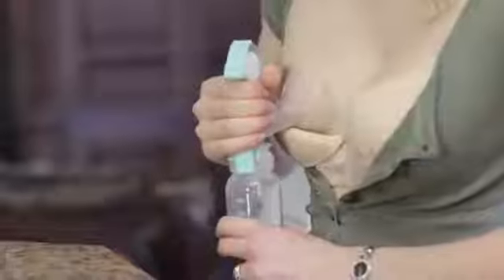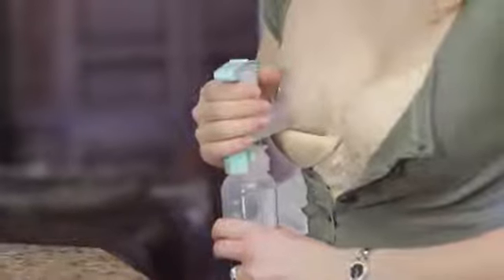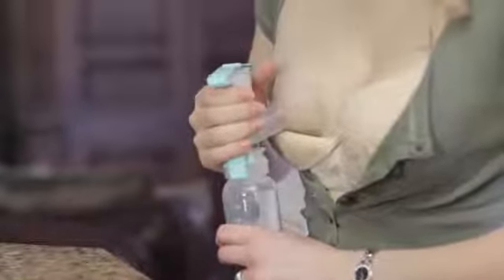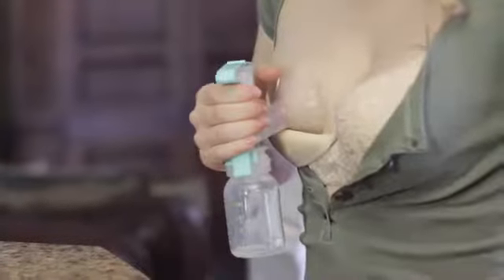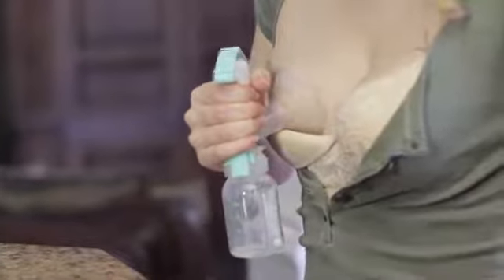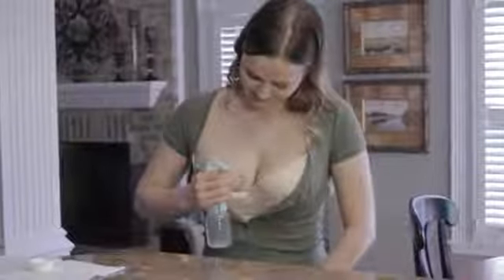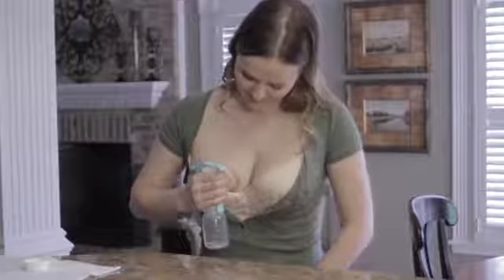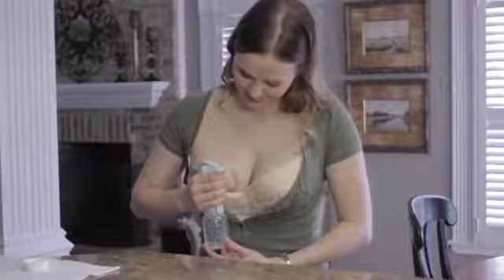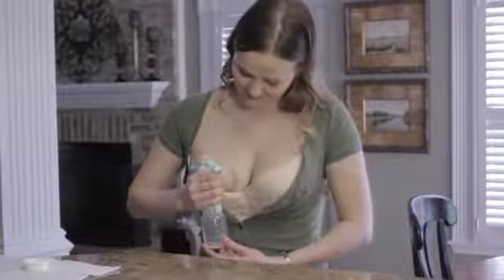You can also try the squeeze, hold, and release technique, which may make manual pumping easier. After the faster, gentle squeezes trigger milk release, squeeze the pump handle, then hold it as your milk flows into the collection bottle. Continue to squeeze and hold while the pump automatically releases suction until you need to stimulate another milk release. Gentle, fast squeezes will once again trigger a milk release.